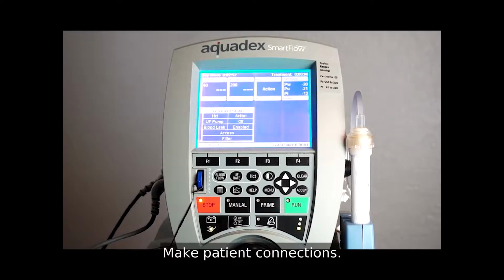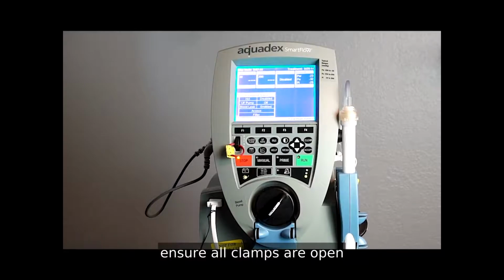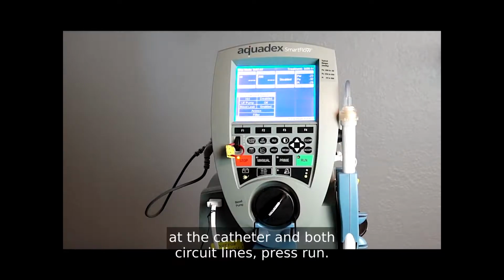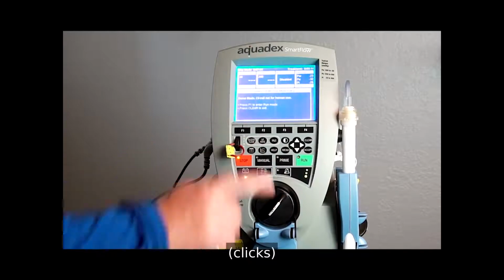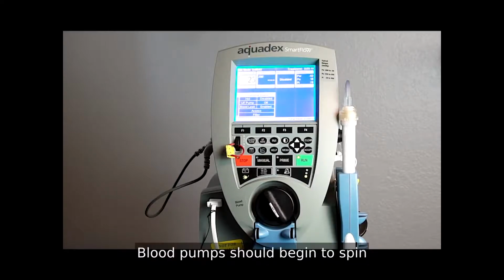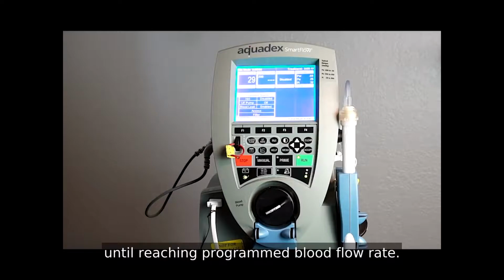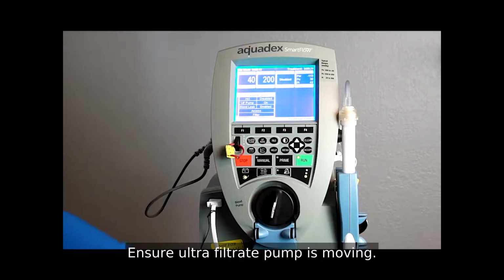Make patient connections. Once patient connections are made, ensure all clamps are open at the catheter and both circuit lines. Press run. Blood pump should begin to spin until reaching programmed blood flow rate. Ensure ultrafiltrate pump is moving.